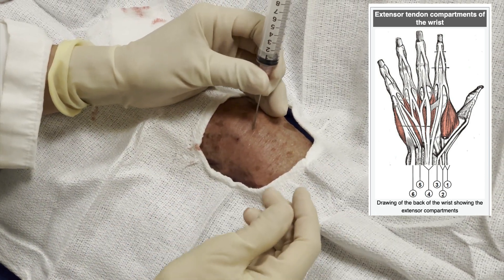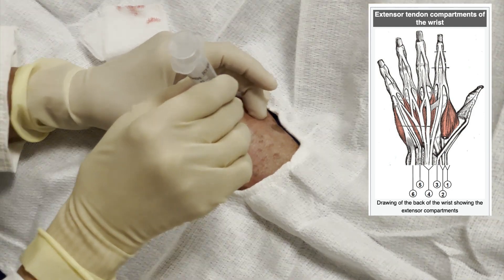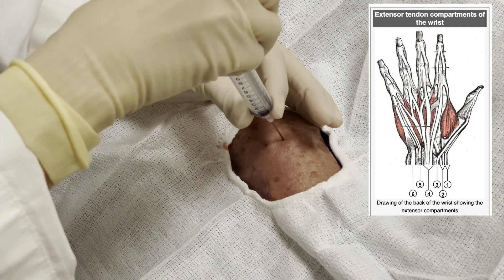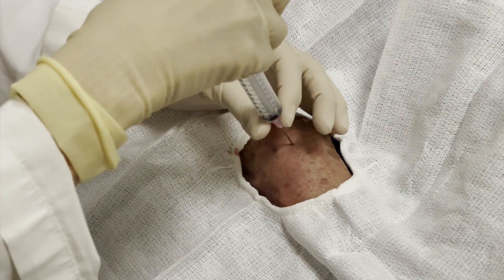I put the needle just where I'm going to insert, and you'll see I poke a little bit just to get the tip through the skin. I did push through the skin as you saw there. Then as I aspirate the plunger, the suction should pull up any fluid once I get into a pocket of fluid.